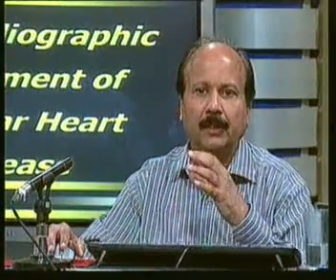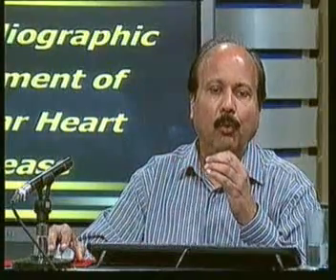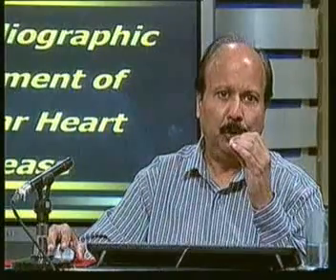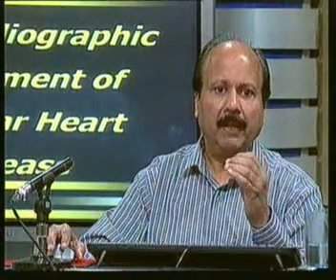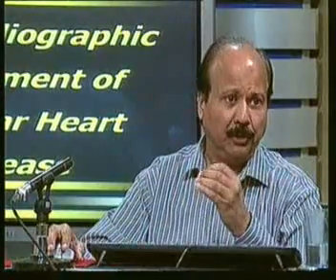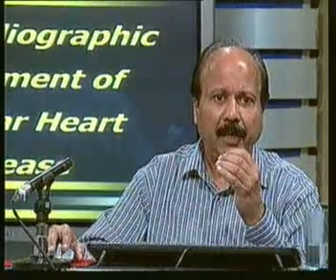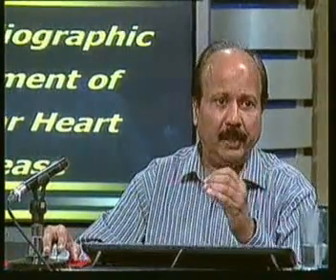And one thing which then comes from there, what route do you take this patient? Is it medical follow-up? Do you give more medication? Do you do intervention, or do you take up for surgery? If you are taking this patient up for surgery, echocardiography will tell you which kind of surgery.